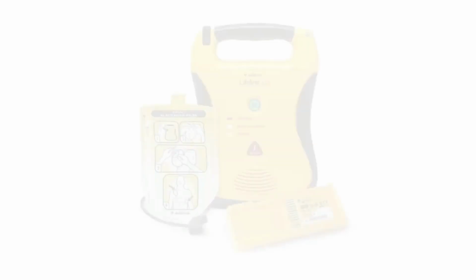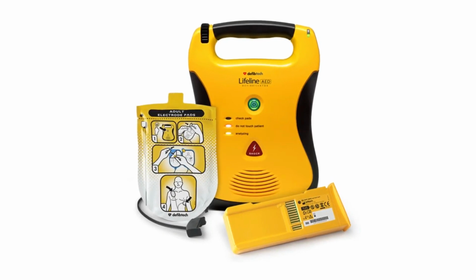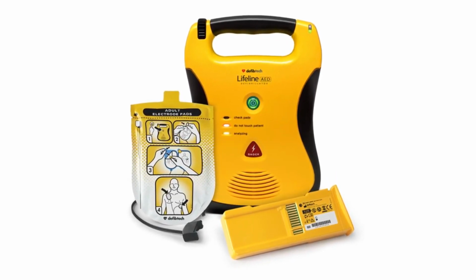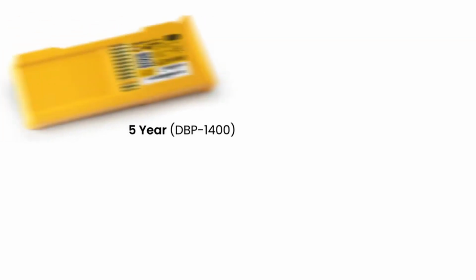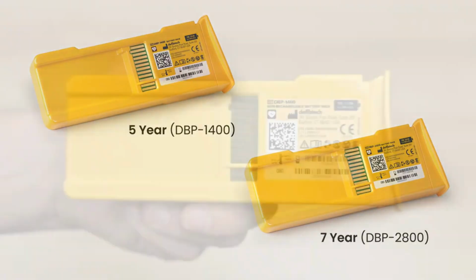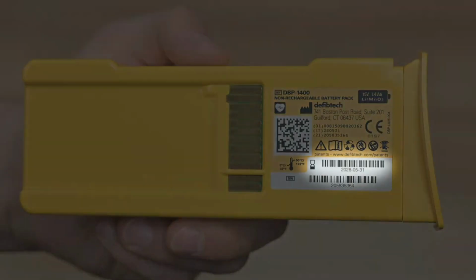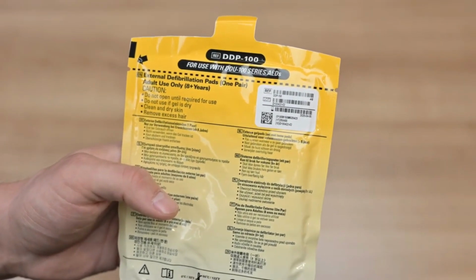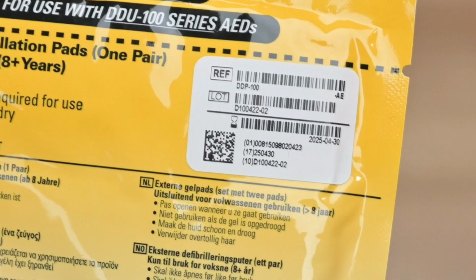It is important to note the expiration date of both your battery pack and your pads. The Defibtech Lifeline AED has both a 5-year and a 7-year battery pack option. The expiration date for the battery pack can be found here. AED pads expire every 2 years. The expiration date on the pads can be found here.